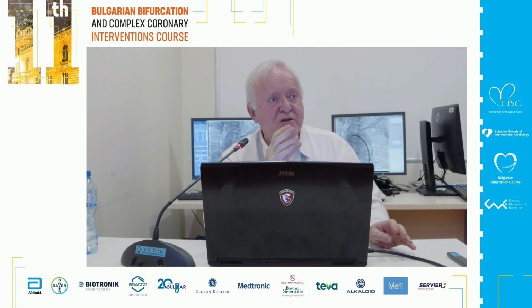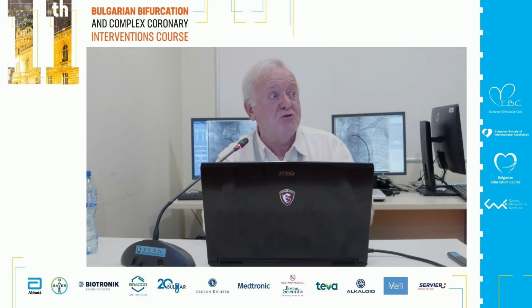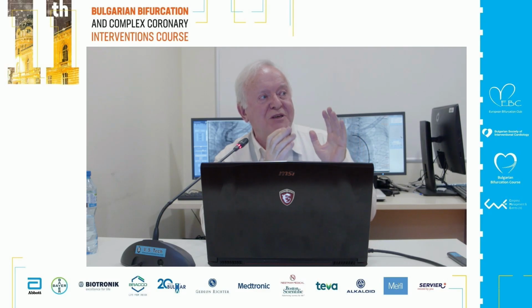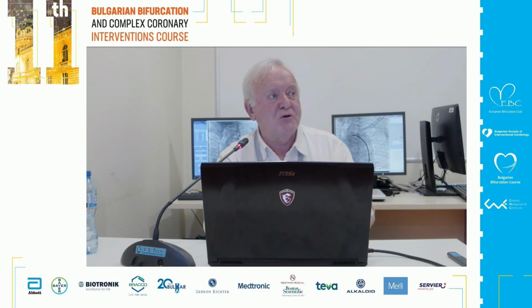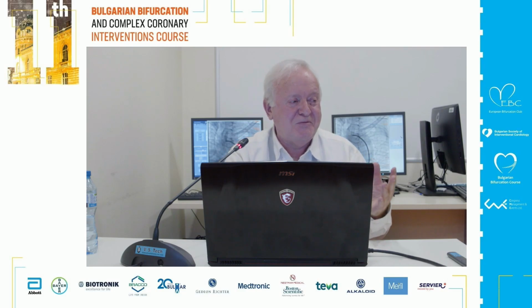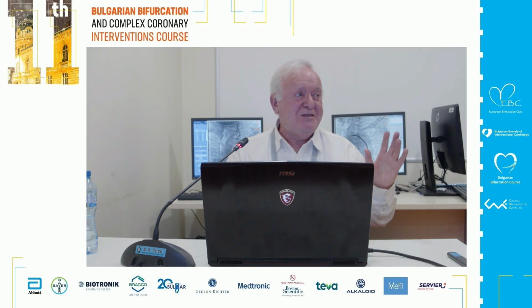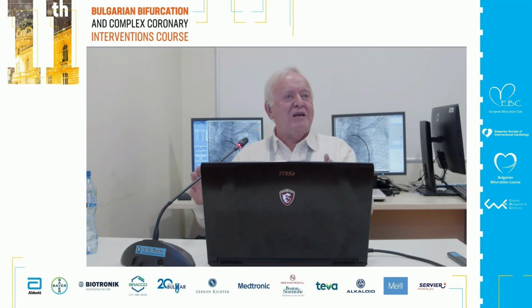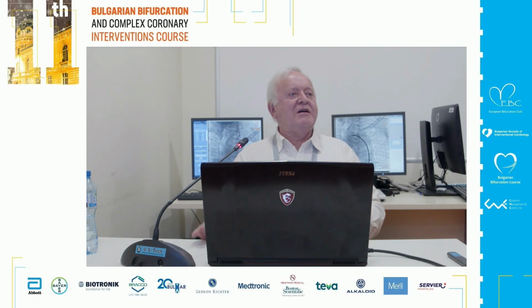I have seen in China, from Xiaoliang Shen, one case which was a 1-1-0, so nothing on the circumflex. The lesion on the proximal LAD was remodeled. He took media to media and he closed the circumflex. So media to media is a big, big mistake. Now I have probably convinced Gary Mintz. He says now, no question, don't do media to media. Try to find a normal segment in the vessel, or calculate. If you have 3 diameters, you can calculate what the normal diameter is.